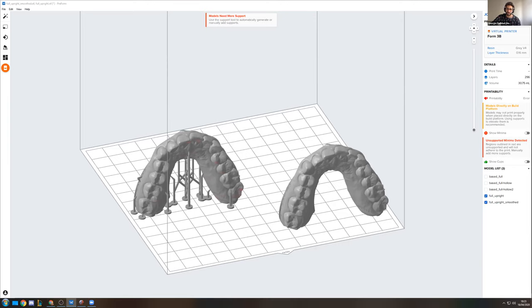third-party resin manufacturers. And adding specifically on printing clear aligners directly, today it's a big challenge to actually 3D print the aligners directly and have the same mechanical properties and characteristics of a thermoformed aligner. So there's definitely a race in that direction, but it will take a couple of years before we get a proper material, and then a bit more to get the right clinical studies around that.